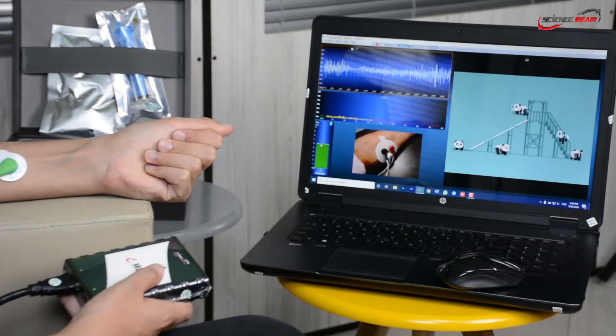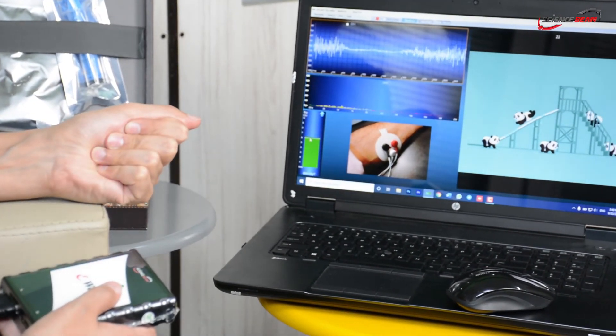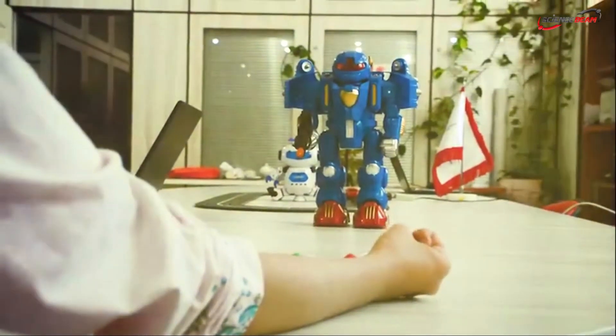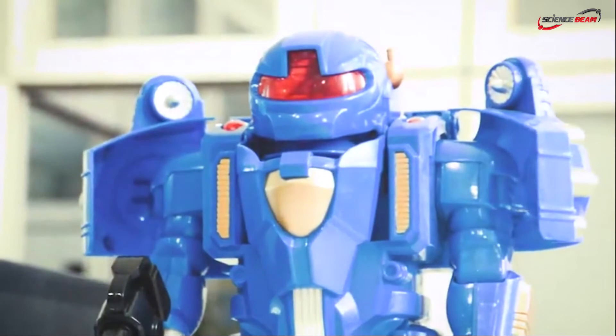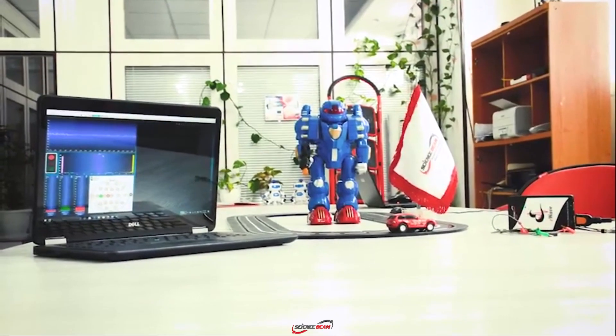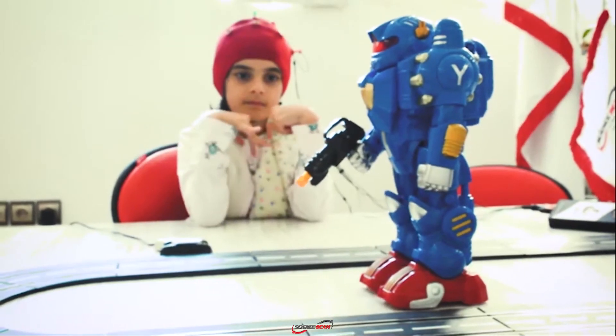Alongside the eBave device, ScienceBeam offers a novel tool to control toys for biofeedback therapy. You can use EMG signals recorded by EMG biofeedback to control remote devices, which can be guided by several parameters relating to online biosignal features.